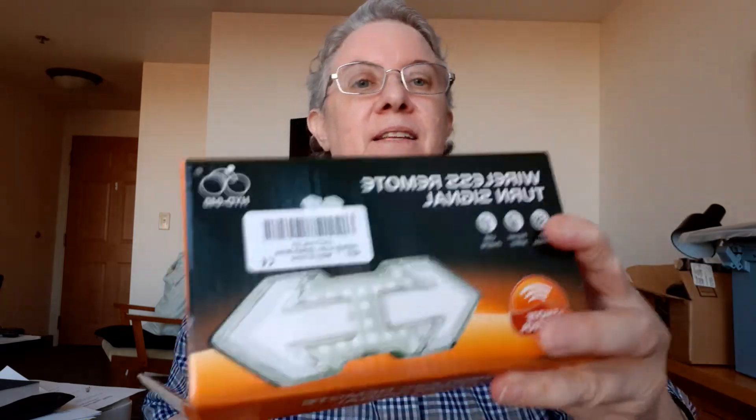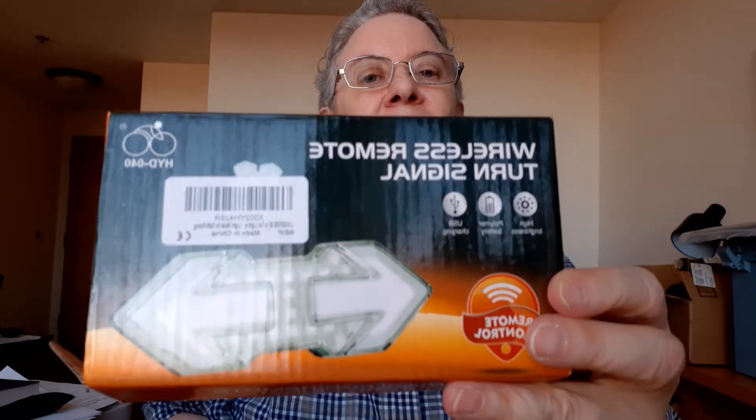So this is the box — this is what it looks like. Your words there might seem a little backwards, but it's called 'wireless remote turn signal.' Here's the charger — it has a USB, so very cool and practical. The size is good. It has hooks in the back — if you can see them — and those hooks are where you're going to use this to hook it around your post.